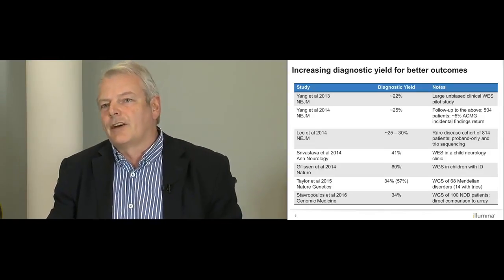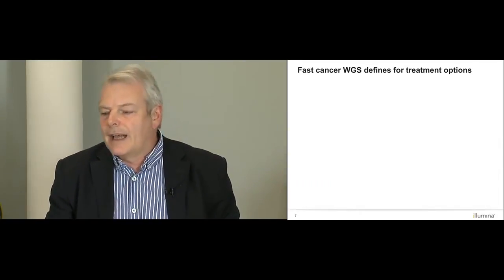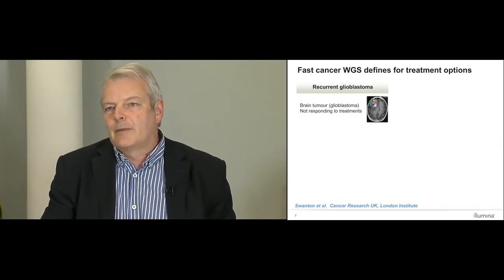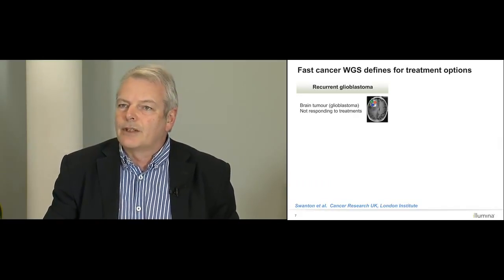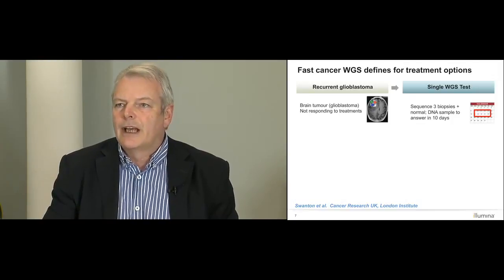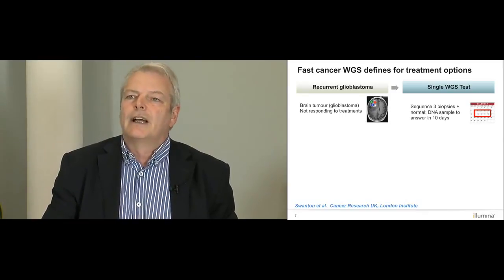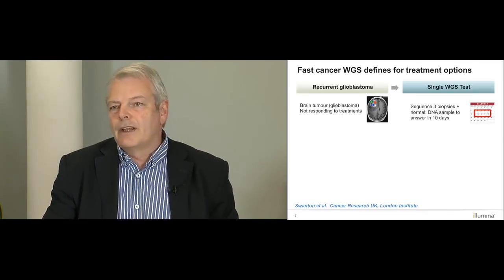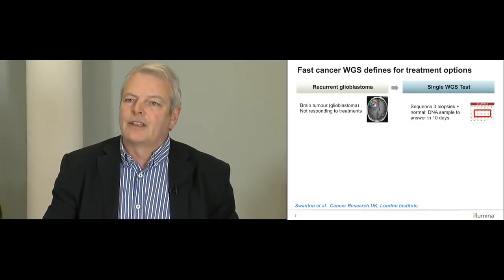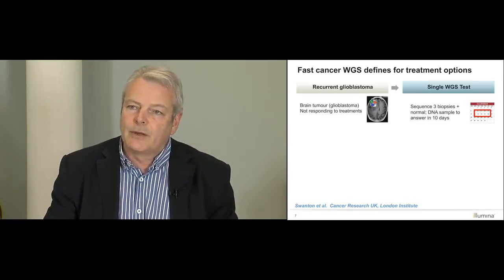Moving on to cancer for a moment, as I mentioned, this is another early interest. A similar anecdote reported here illustrates that in this case, a recurrent glioblastoma, which was not responding to treatments, was biopsied and sampled. In this case, 3 biopsies were sampled, again in a clinically relevant turnaround time. This is actually a 10-day turnaround to get the 3 results. One of the interesting things about this case is not only that the clinical turnaround time was again relevant to the management of the condition, we returned the data back before the patient was ready for treatment.